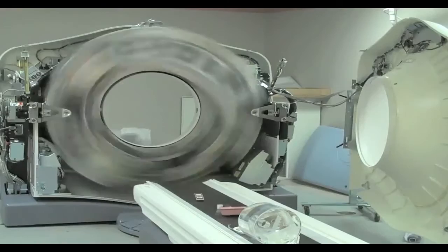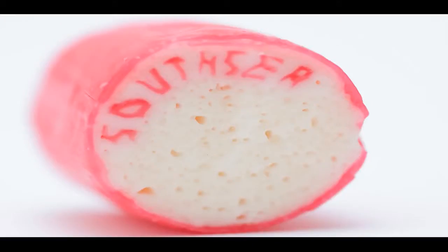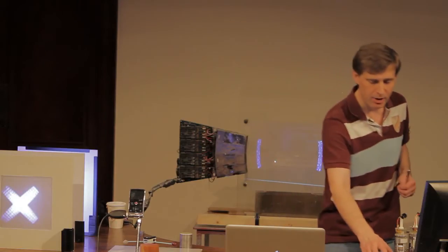Okay, well, let's get on with the business of explaining what's going on inside one of these things when it builds pictures of slices. We're going to make life really easy for ourselves by taking the simplest object we can think of to put in our scanner. And we're going to choose a stick of rock, because a stick of rock looks exactly the same. Doesn't matter how you slice it up, it looks the same at every slice. So let's make life a little bit more interesting by putting a mystery celebrity face inside our stick of rock, and let's put it inside the scanner.